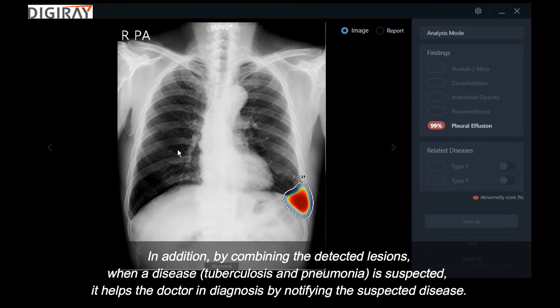In addition, by combining the detected lesions, when a disease such as tuberculosis or pneumonia is suspected, it helps the doctor in diagnosis by notifying them of the suspected disease.